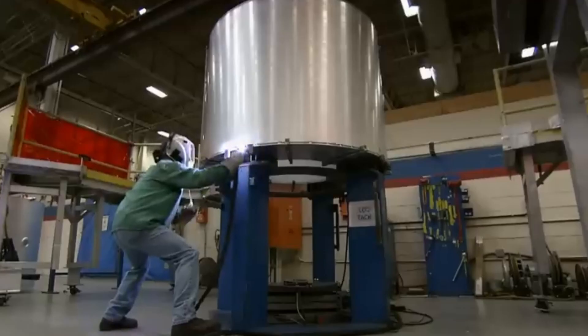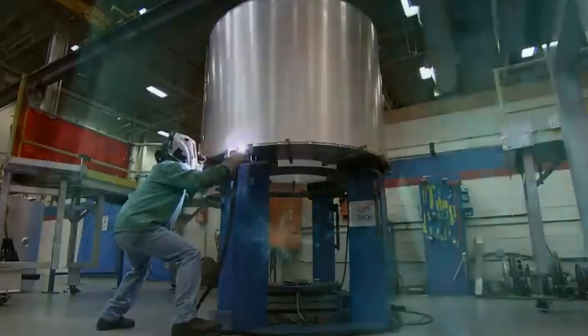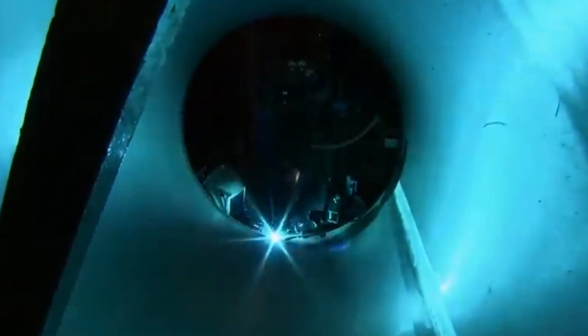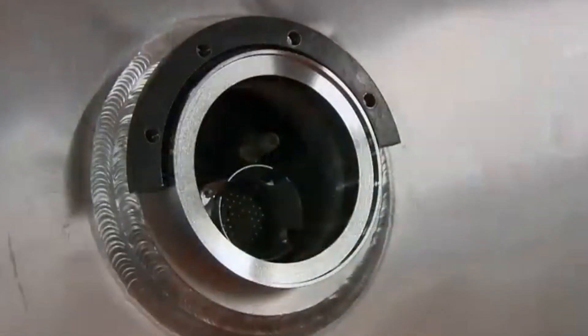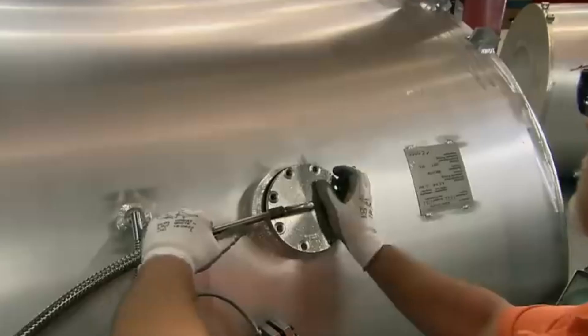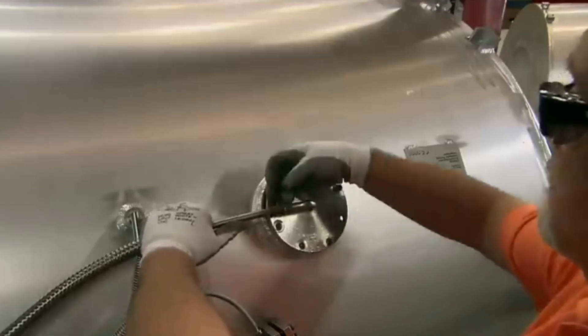They weld aluminum casing around the magnet, creating a tunnel in the center for the patient. The seams must be extremely tight, because the tube will also contain the super-cold liquid helium, which will make the magnet so incredibly powerful. Once the welds are complete, they cap the magnet and transfer it to a test chamber.